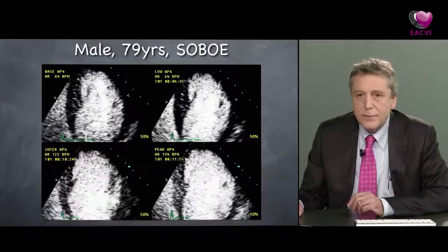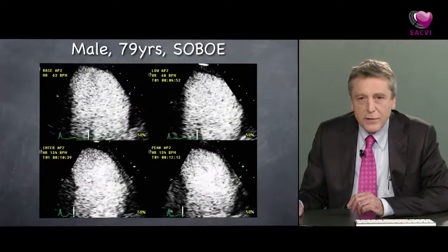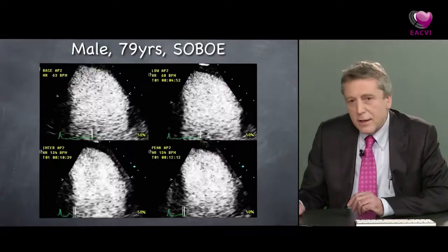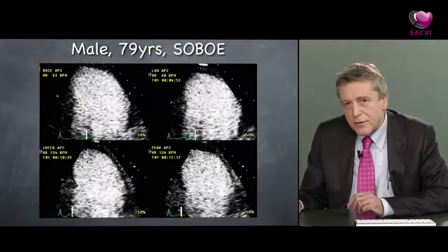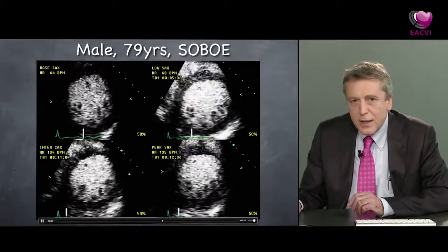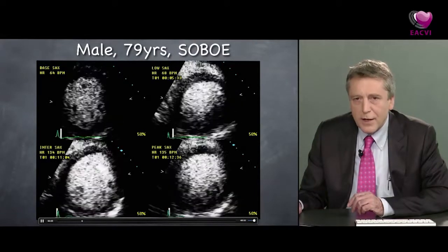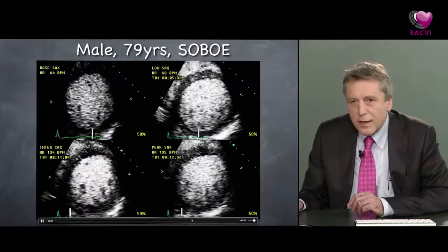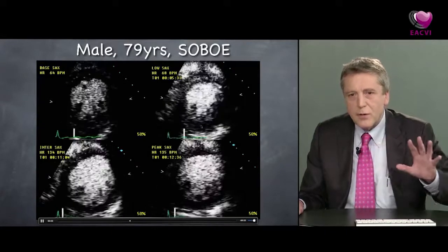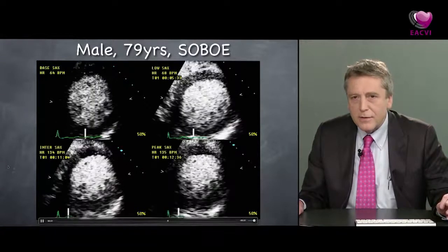Here is the 2-chamber view. Again, peak is on the bottom right, and the baseline is at the top left. A short axis view. Actually, just as an incidental finding, you can see here the contrast level is really not quite high enough in that baseline image. It's just about good enough to see the endocardial border, but it's not quite as high as I would like it. And here we've got a little bit of attenuation. So just a couple of examples of some artifacts there that are not completely spoiling the image quality, but are just subtly present. And here finally is the long axis view.